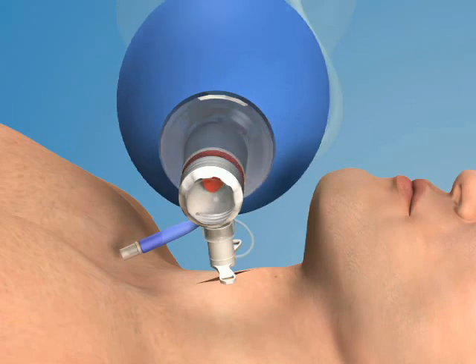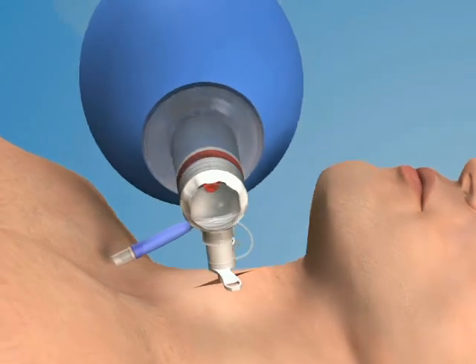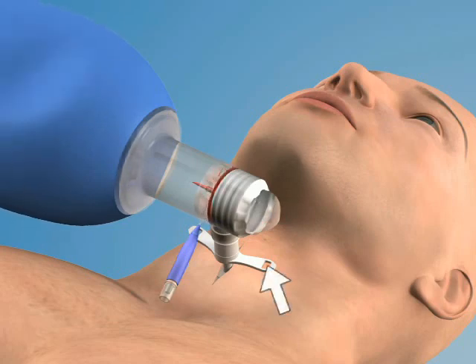Proper catheter placement may be confirmed using auscultation and end-tidal CO2 detection. Secure the catheter to the patient using cloth tracheostomy tapes that have been threaded through the flanges of the catheter.